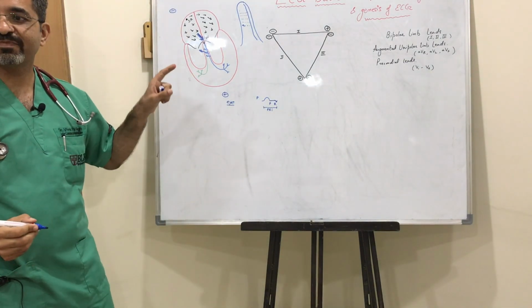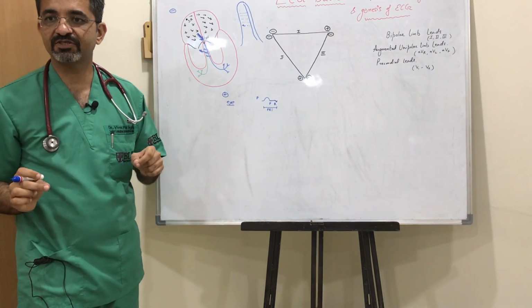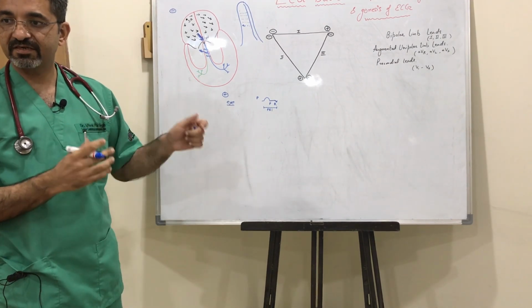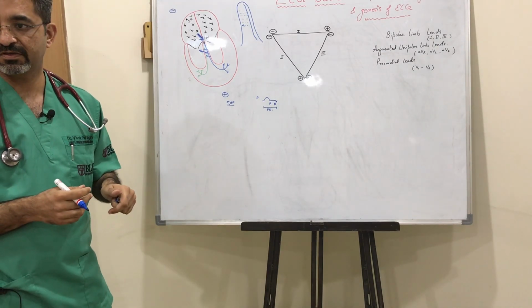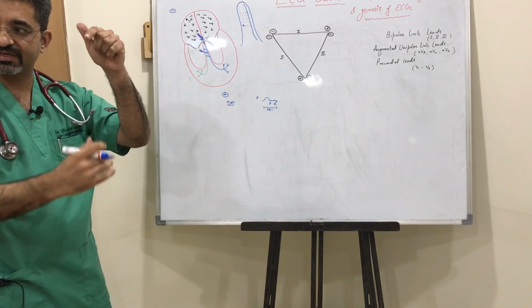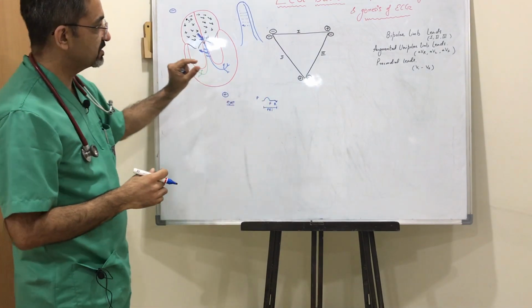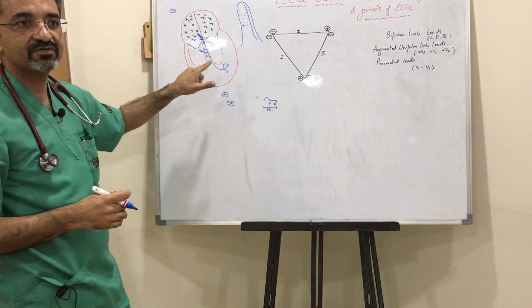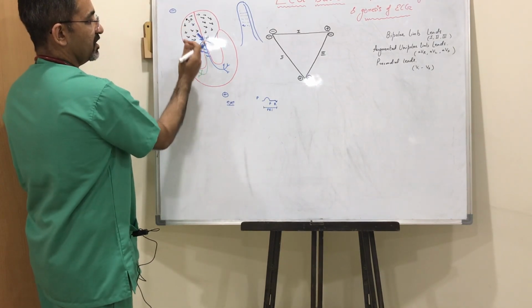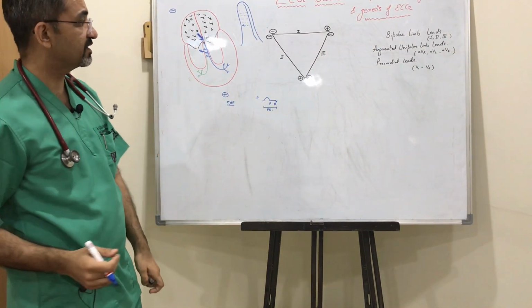So Q wave is not pathological. This is a physiological Q wave. A small Q wave is a physiological Q wave, which means the septum has depolarized. In better terms, it is known as septal Q wave. It can be pathological in certain leads where it shouldn't be, or if it's very wide or very deep, then it becomes pathological. Otherwise, a small Q wave is a depiction of the vector of septal depolarization, which is slightly going up away from my positive eye of lead 2, right?